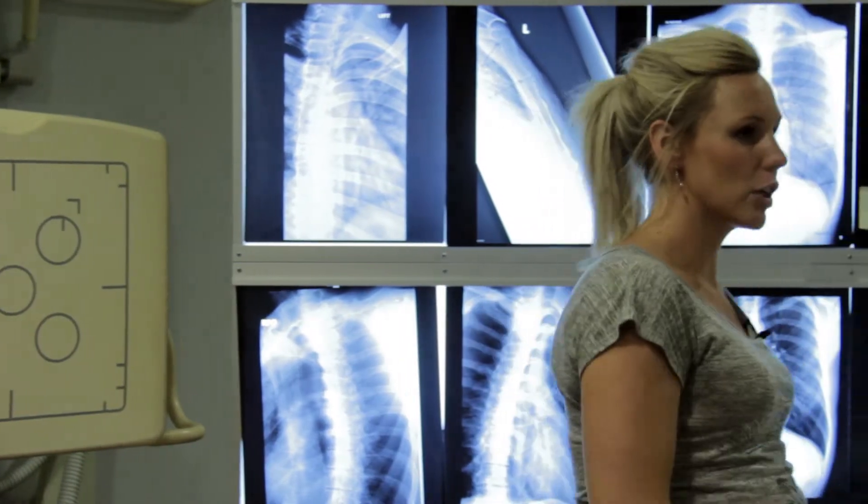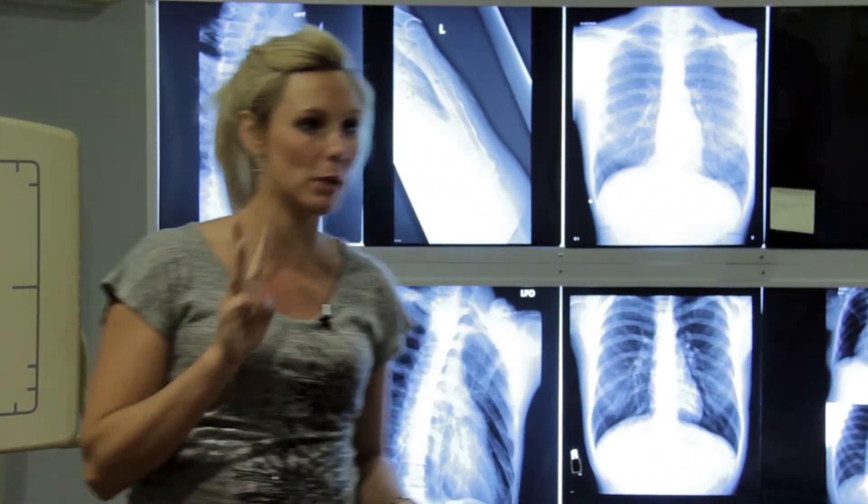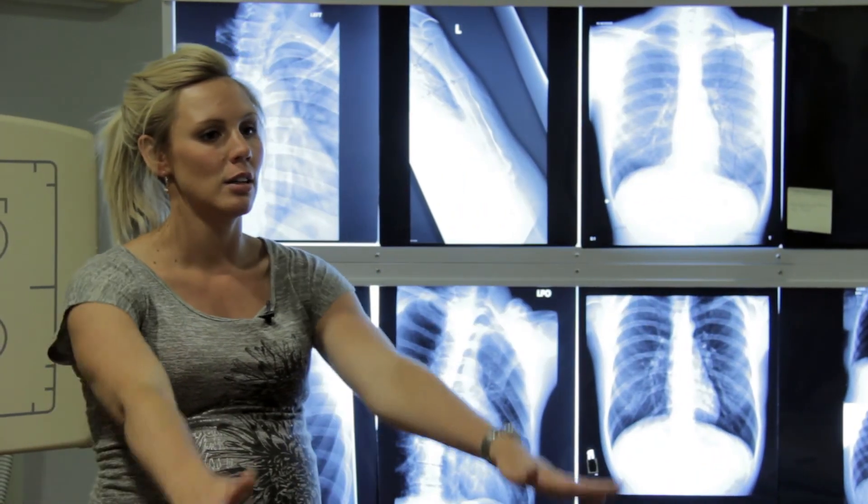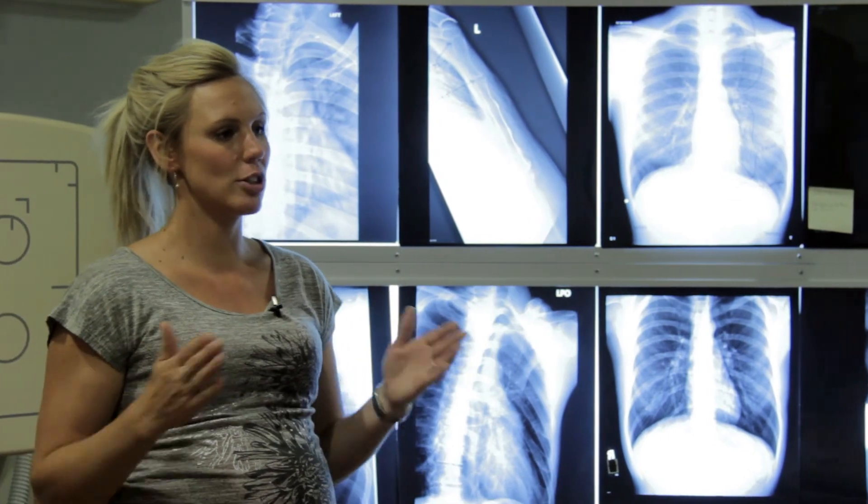So you do your first four upright pictures, then bring them over and lay them down on the table — now we have three more pictures to do, the same three pictures we did with the upright. When you're doing lower ribs, they're going to be recumbent. It doesn't matter if the BB is front or back — you will lay them on their back. You're not going to make a patient lay face down. All of your recumbents will be on their back. The first picture is a straight ray, an AP supine, centered to the area of interest.